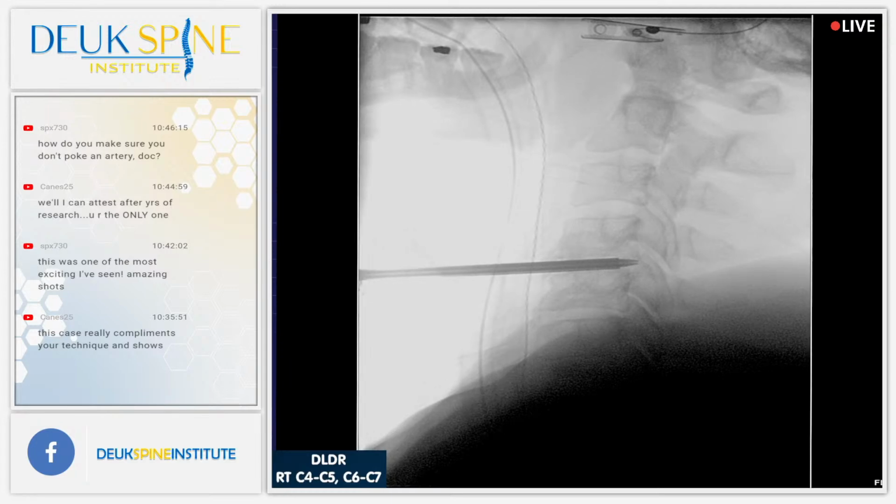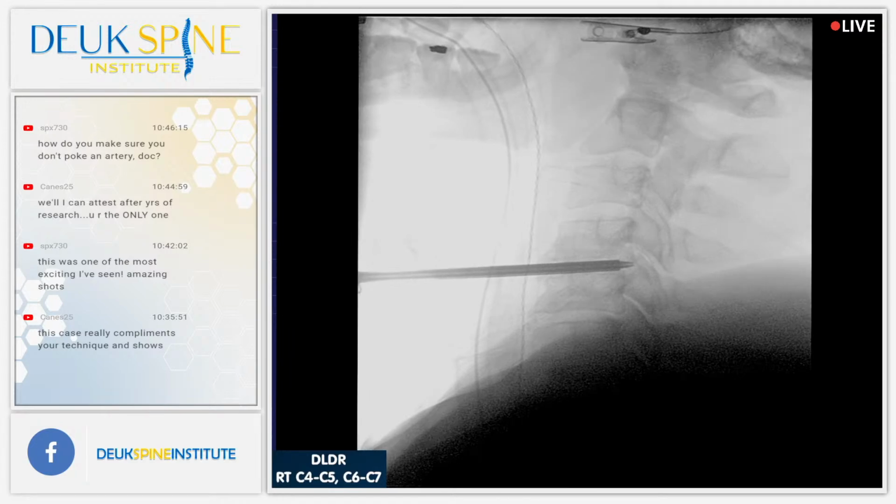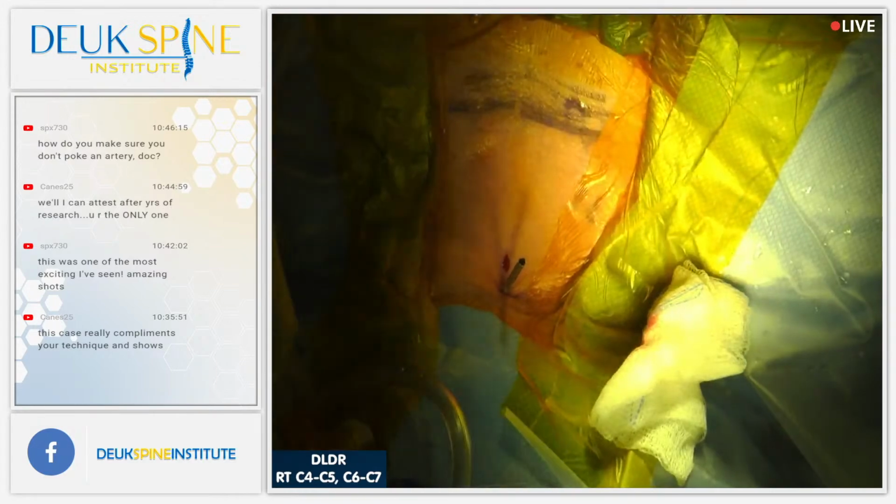And the cheap machines and the used machines, well, they have something in common, and that is that the quality of the pictures is horrible. And if the quality of your picture is horrible, how can you pound in a tube over the spinal cord if you can't see it, right? And that's exactly what they do. They do procedures without really being able to see what they're doing.